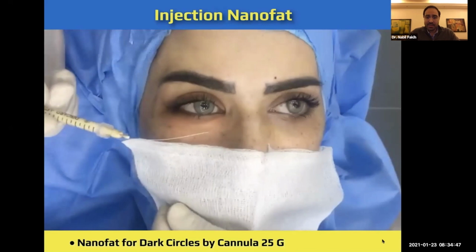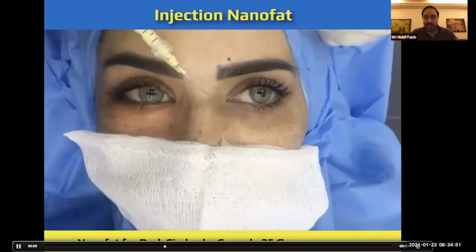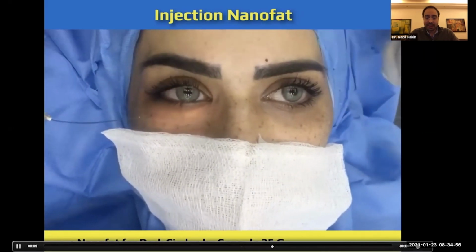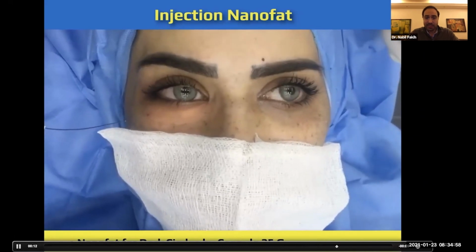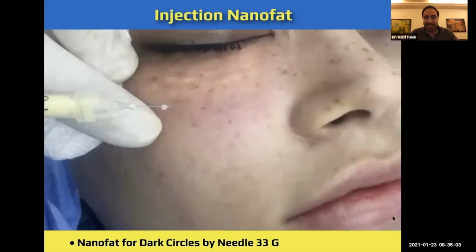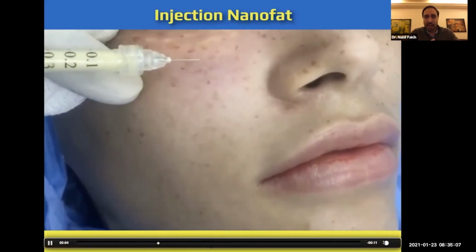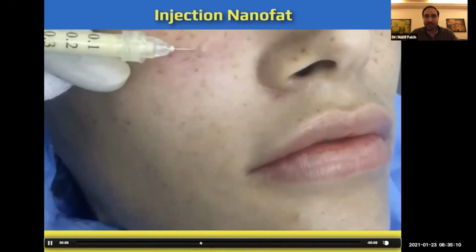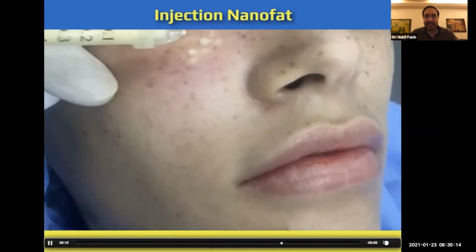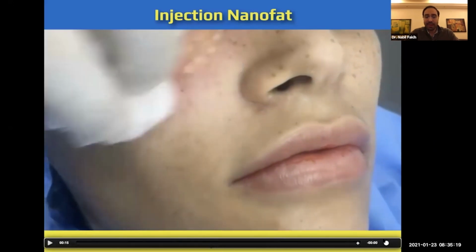As you see, we injected nanofat with cannula, but I've seen that you should also inject nanofat with needles, because if you inject under the skin, it's totally different than if you inject intradermally. With cannula, you're not injecting technically intradermally. Patient has anesthesia. I should really push. After doing with a cannula, I should push inside really to create this yellowish effect under the skin of all the dark circles. And technically, I prefer to inject with needle after I inject with cannula.